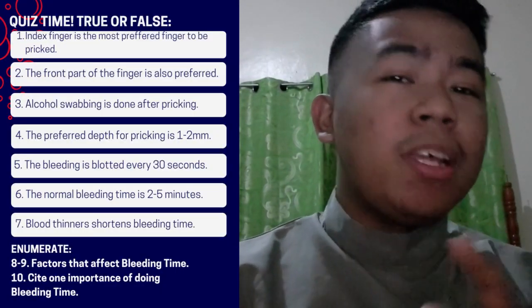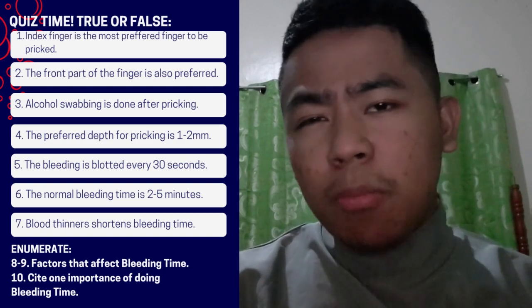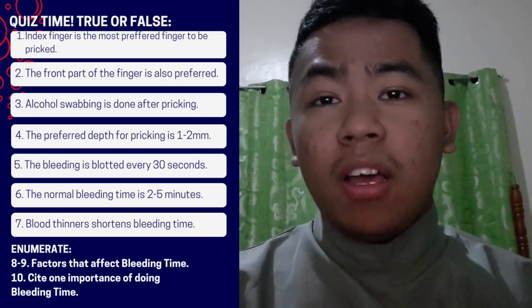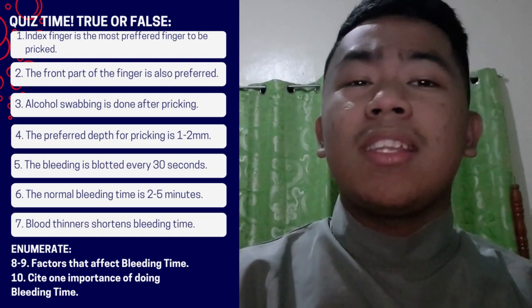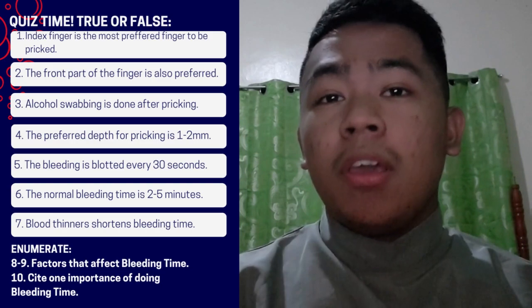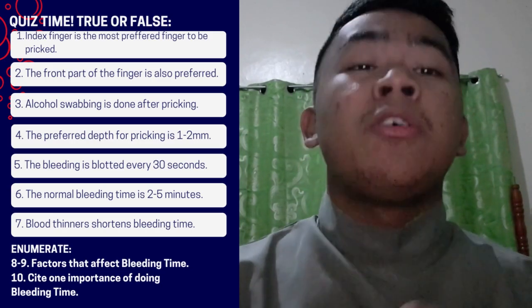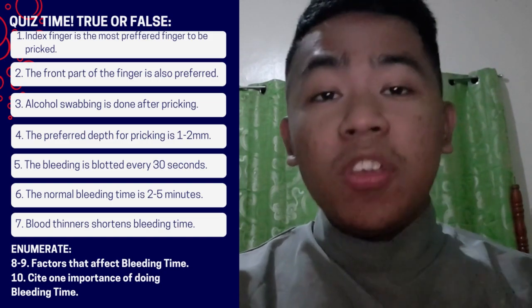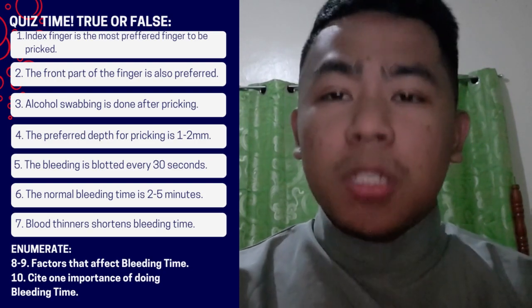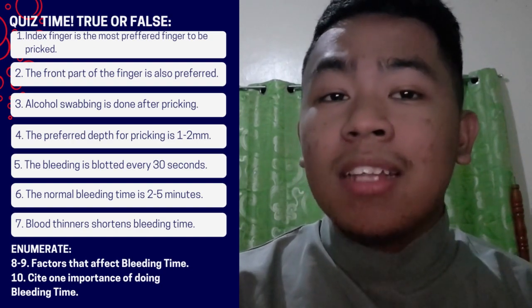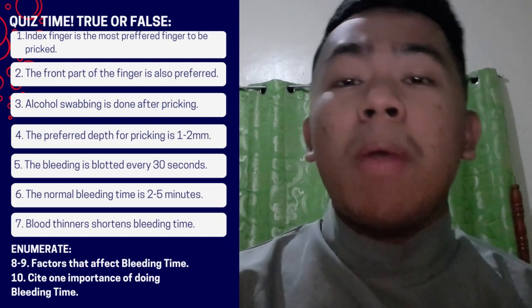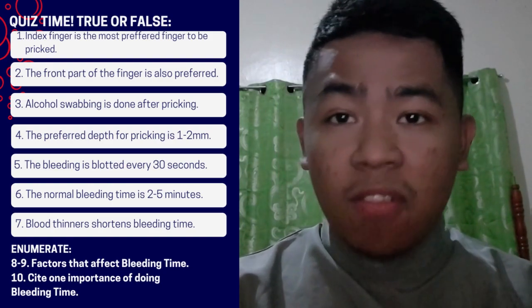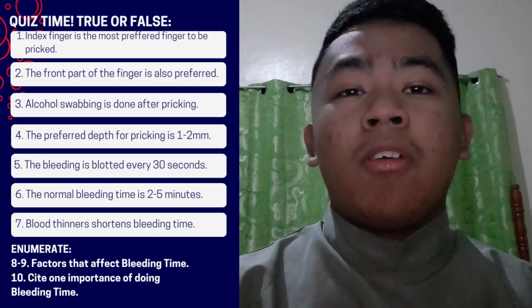Great job everyone on the bleeding time test demonstration. I noticed that most of you were able to properly sterilize the puncture area and follow the correct procedure. However, a few of you seemed to struggle with keeping the wound site clean and free from contaminants. Remember, it's important to maintain sterile conditions and ensure prevention of infection during this procedure to ensure accurate results. I also noticed that a few of you had trouble accurately timing the bleeding — make sure to pay attention to the stopwatch and record the exact time to the nearest 30-second interval. Also remember to blot the bleeding after the first 30-second interval of bleeding, not the first instance of bleeding. Overall, I'm proud of the progress you've made.